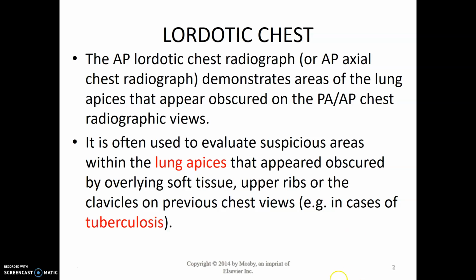So the main focus of Lordotic Chest is the lung apices. And our number one reason that we do it is usually tuberculosis. Also, sometimes it could be for masses or nodules, but number one and textbook wise would be for TB.